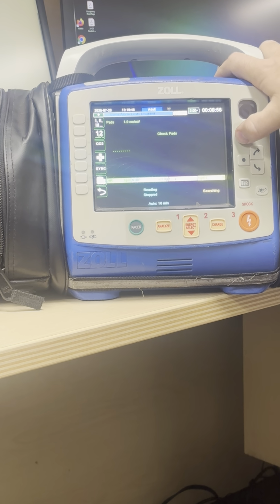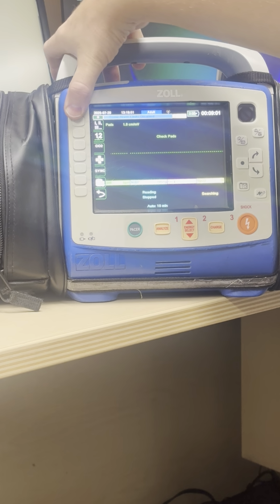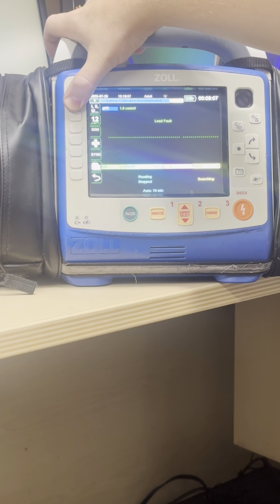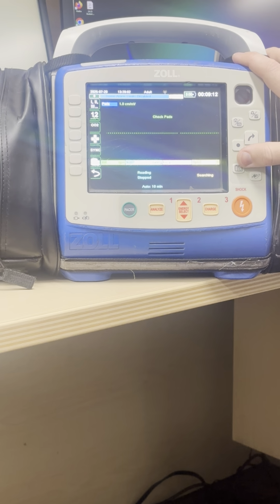Next, we're going to change the lead view. So coming back to this home screen here, you can click the 1, 2, 3 top key on the left. It'll cycle through the different leads: 1, 2, 3, AVR, AVL, AVF, and pads. That's how you cycle that.